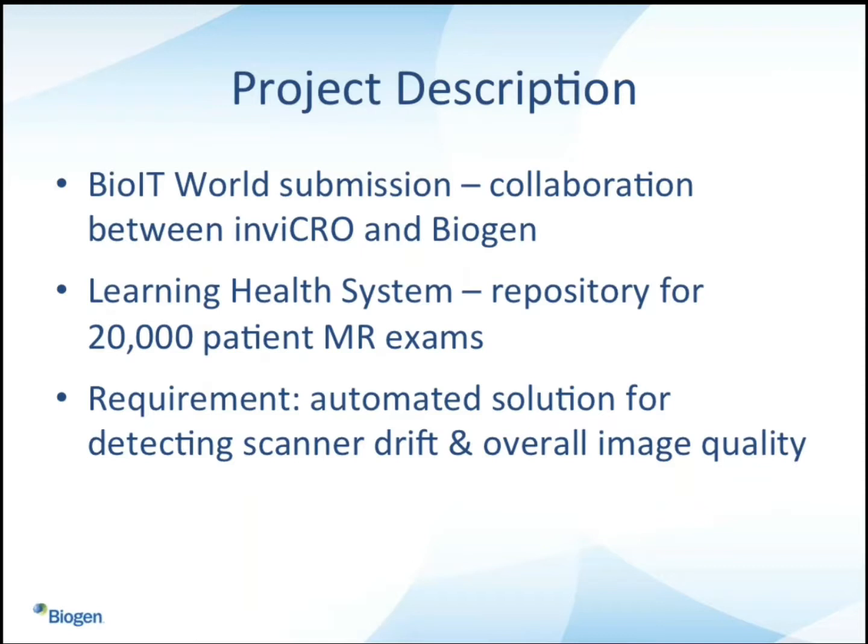The work that went into standardizing each healthcare institution's radiology environments involved designing and implementing product sequences that had very specific acquisition parameters, TR, TE, things like that. And then they were optimized to be most amenable to our brain volume and T2 lesion volume segmentation algorithms that we're developing at Biogen. So they were very specific.